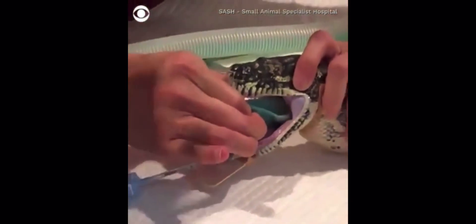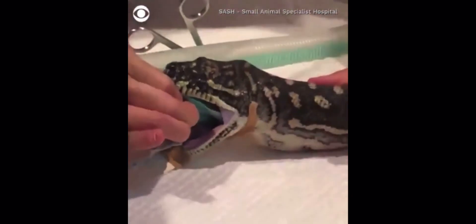Okay, that's right, we've got it, we've got it. No, it'll come out. We've got the tip of it, let's just get that back in. We can use these ones to pull that out. Do you want to do the honours?